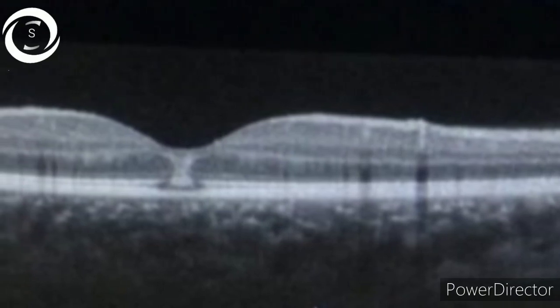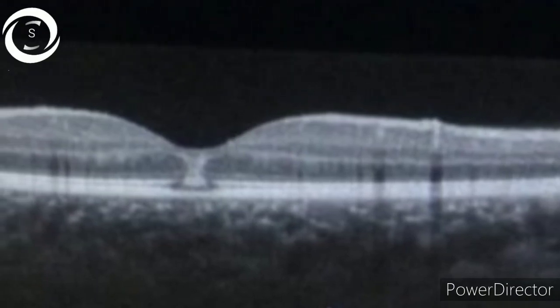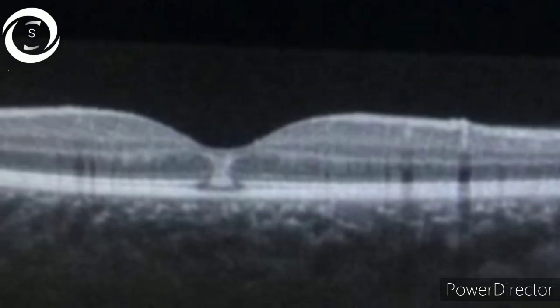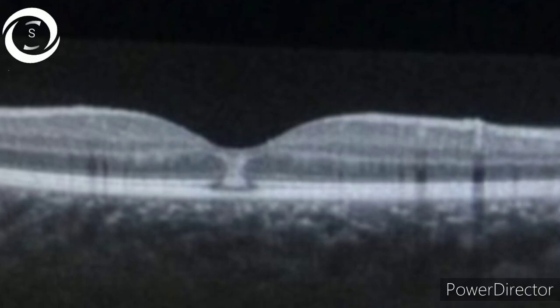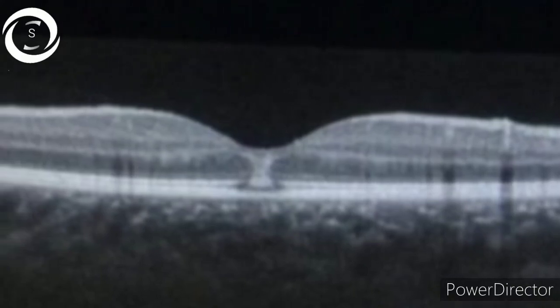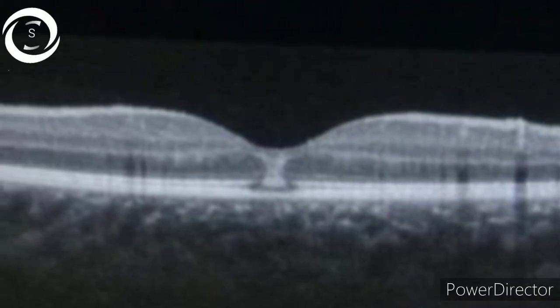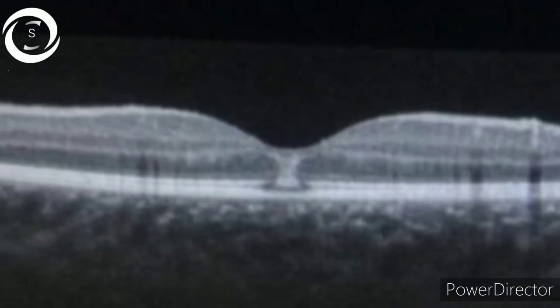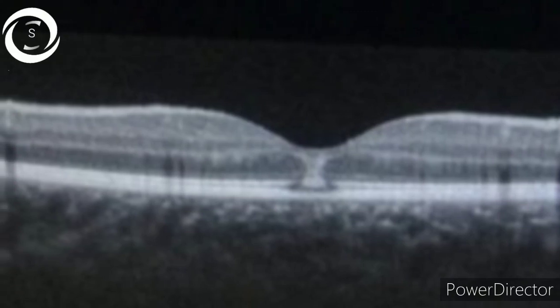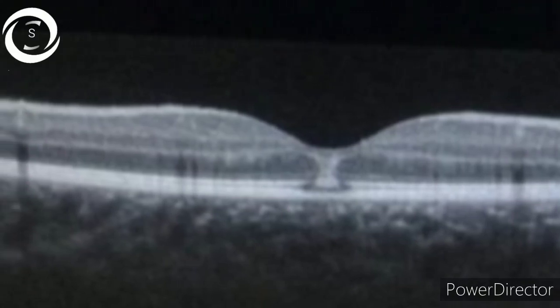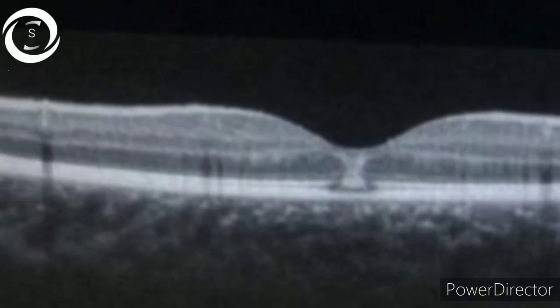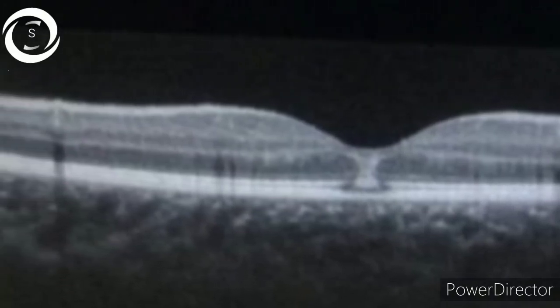In the last OCT, you can appreciate the focal disruption or loss of RPE and ellipsoid zone with a vertical band-like hyper-reflective material and sharply demarcated borders with adjacent normal retina. This is solar retinopathy.